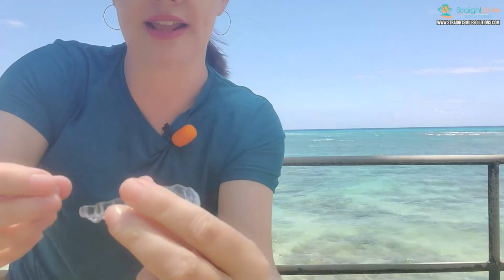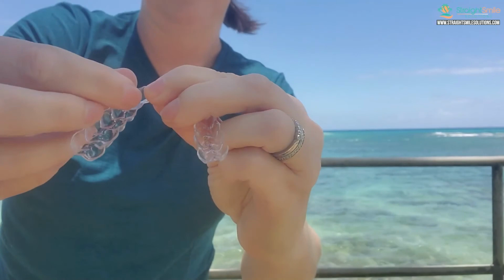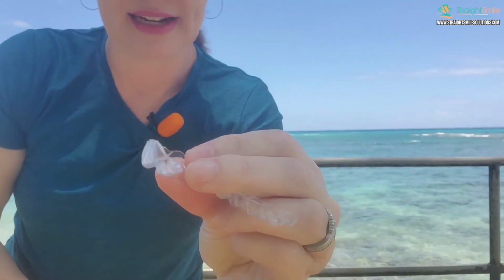Okay. So here we go. I've never tried this before, so I'm literally winging this. But let's say, you shouldn't have sharp edges on aligners, but sometimes you do, and the patients get bothered by it. So they said it sticks right on. I'm going to say a no to that. I don't like it, but I think it seems great for braces. So to me, it doesn't seem like it's sticking very well; it stuck a little bit.